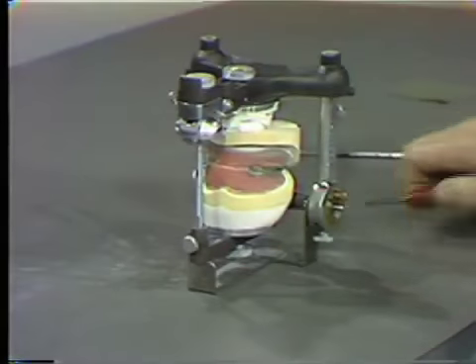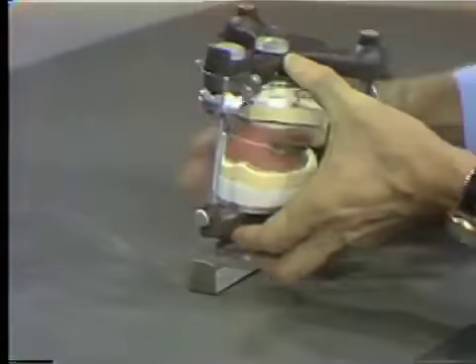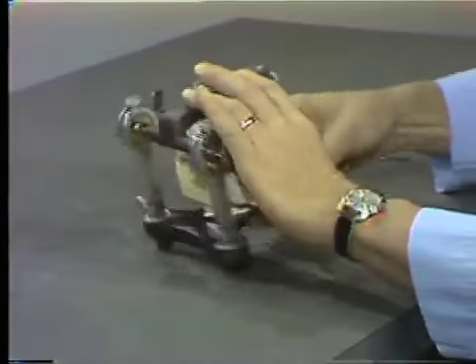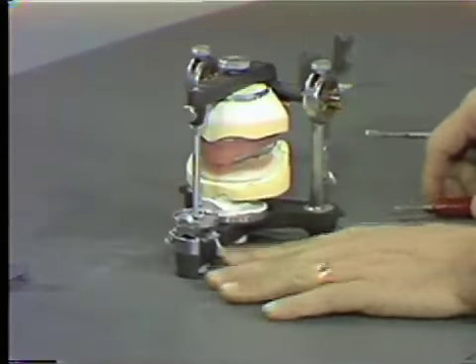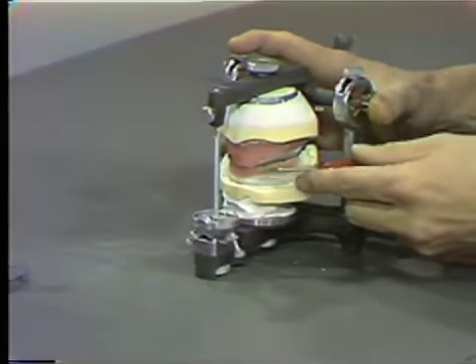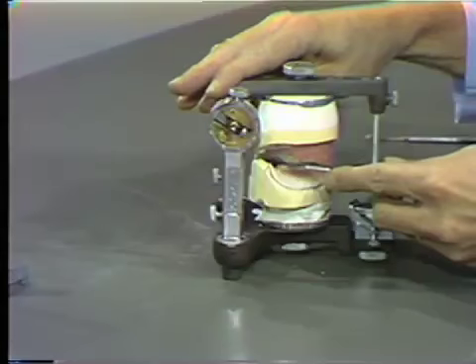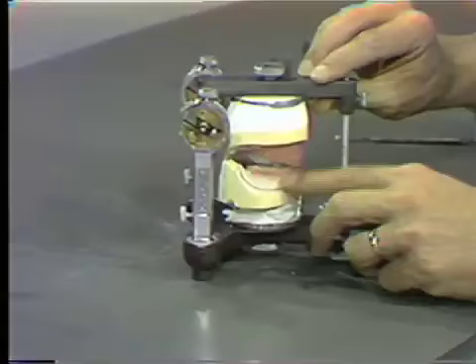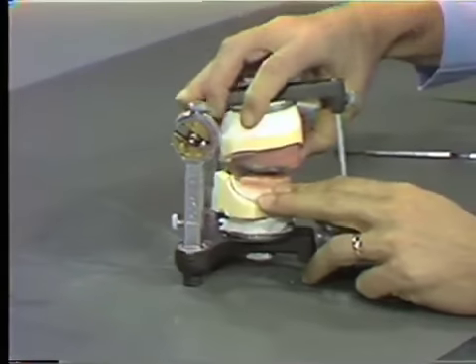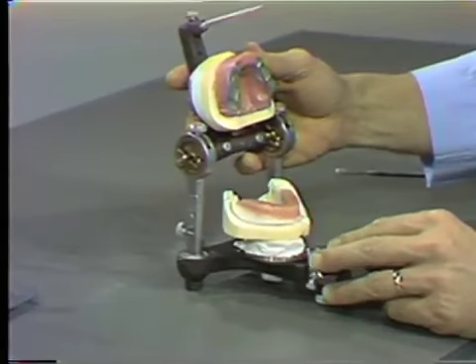The plaster has now set, so we can remove the articulator from its mounting stand, and we're ready to separate the two rims from each other. Now, if we will use a knife, and we'll cut through the area where we sealed the two rims together on both sides, and this is important. We don't want to attempt to force these apart. We want to cut them apart. So the opening of the articulator and of the rims will not be placing unfavorable leverages on our mounting.